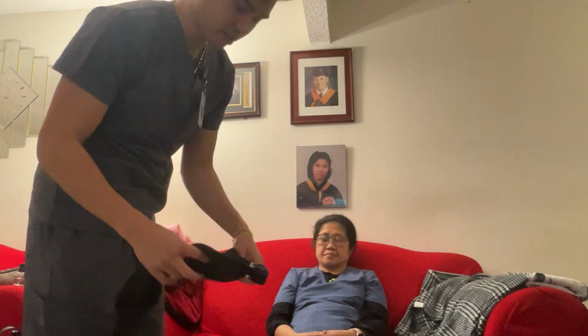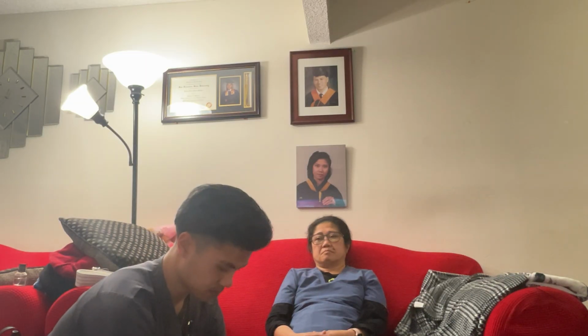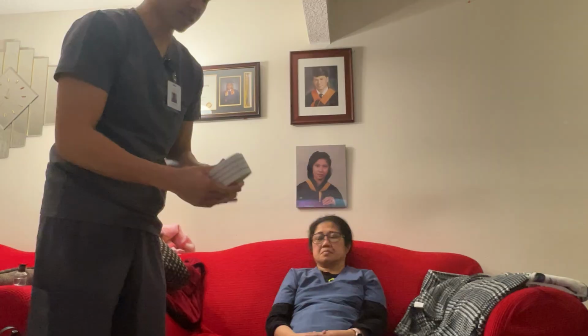So now I'll be putting on these non-slip socks. And in doing that, I would also ask the patient if they have a strong or weak side. Do you have a weak side by chance? The right. Your right side? Okay. So now that the patient identified their weak side, I would be supporting the patient from the right side. All right. Both the right and left are on. So now that we have the non-slip socks on, now we're going to be putting this Gait Belt on.